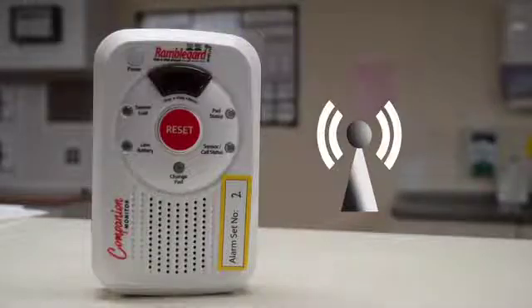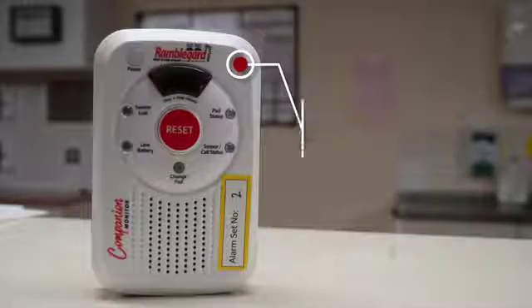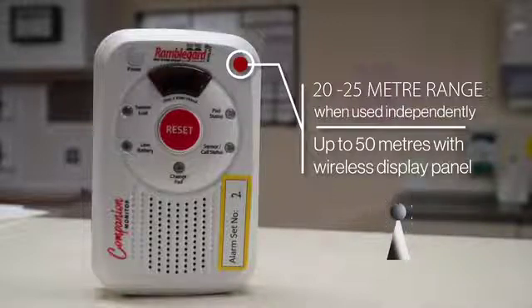It has the ability to transmit to a pager to increase range when the companion is used as a room monitor without the wireless display panel. It also has a 20 to 25 meter wireless range when used independently and up to 50 meters when used with the wireless display panel.